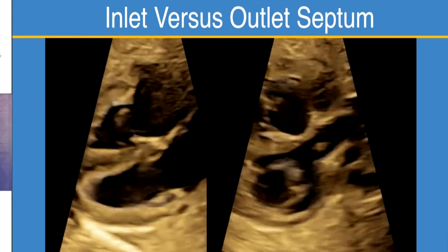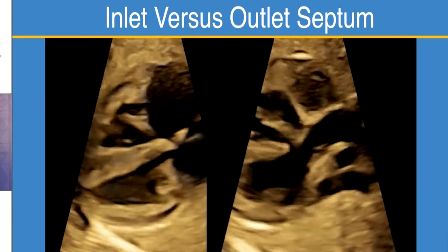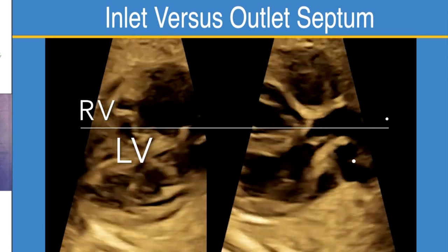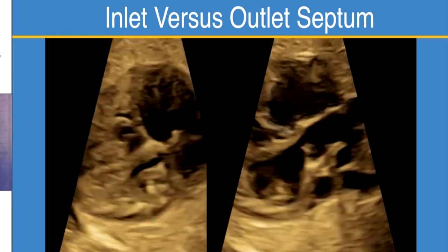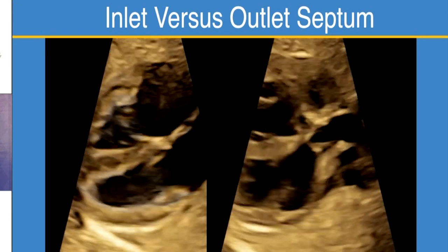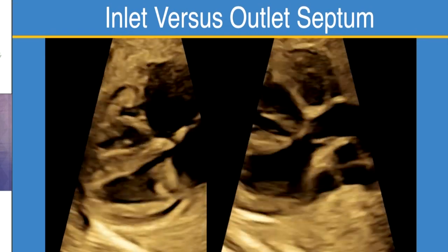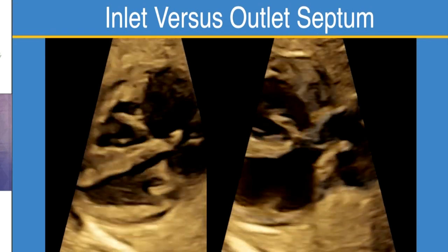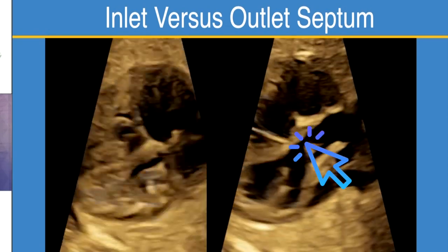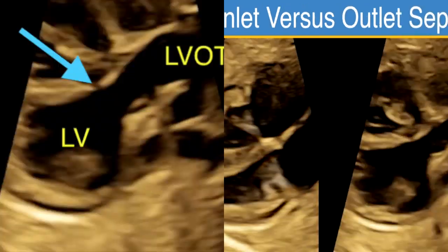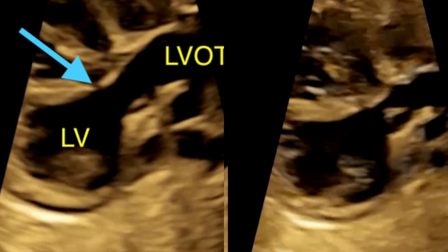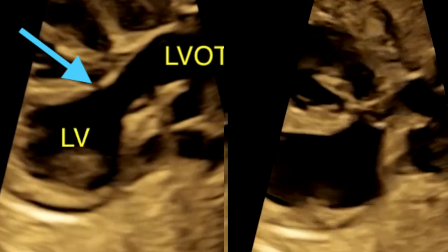To make sure everyone is aware: this is the four-chamber view portion of the ventricular septum. The inlet septum is here — you can see the mitral and tricuspid valves being offset — and this is the atrioventricular septum, with the rest being muscular septum. This other view shows the outlet septum because we see the aortic valve, and here you can see a small VSD in the membranous septum. That is not really a four-chamber view abnormality — it belongs to the outlet septum.